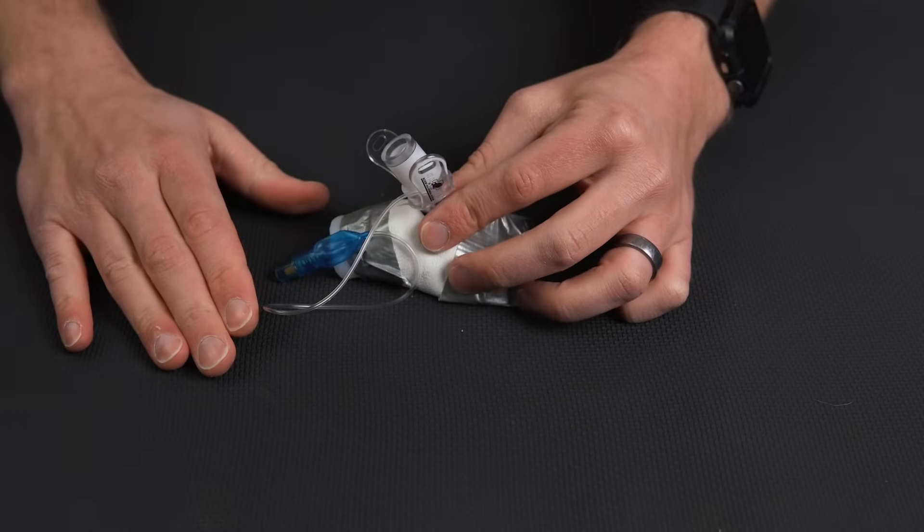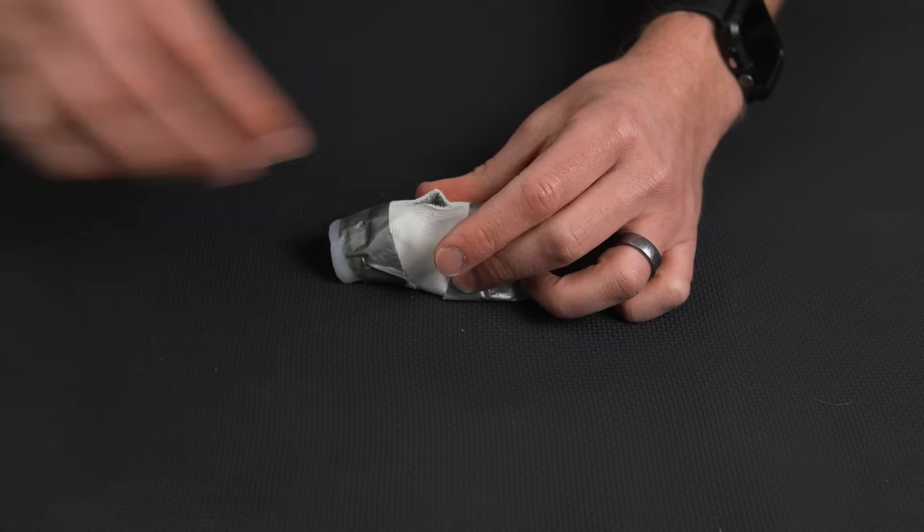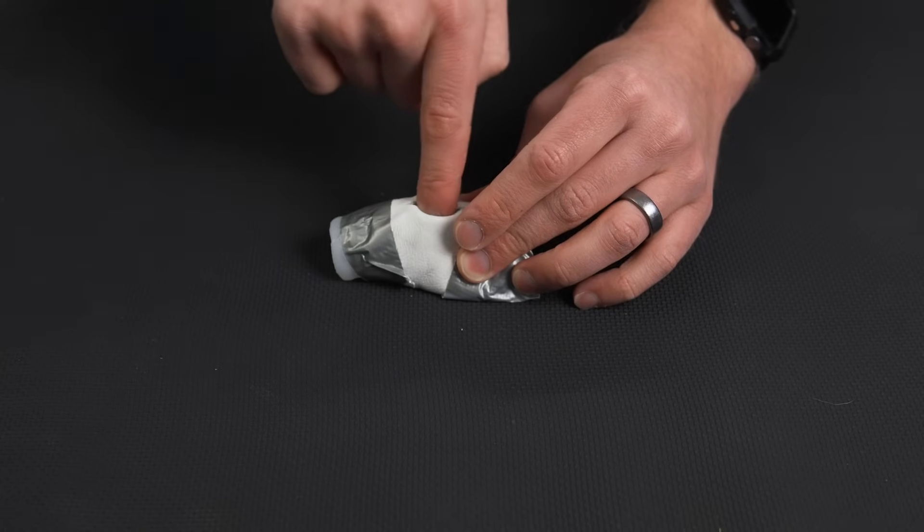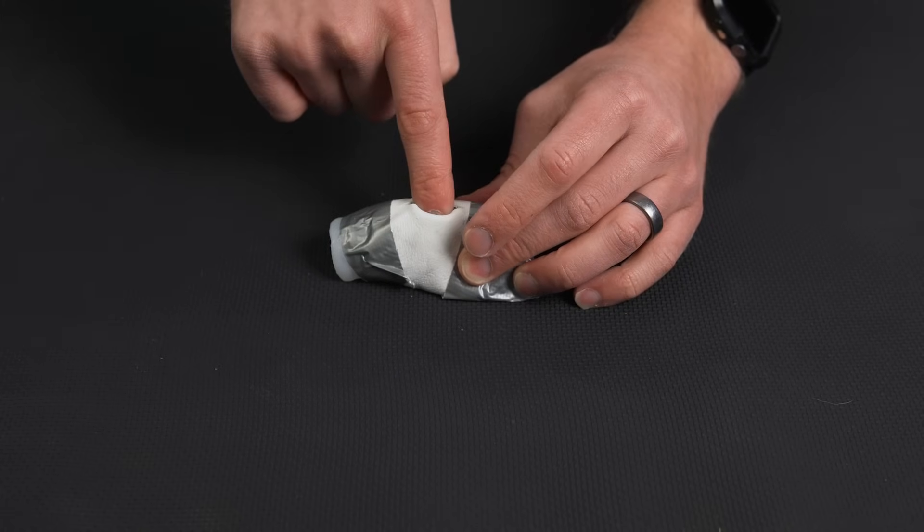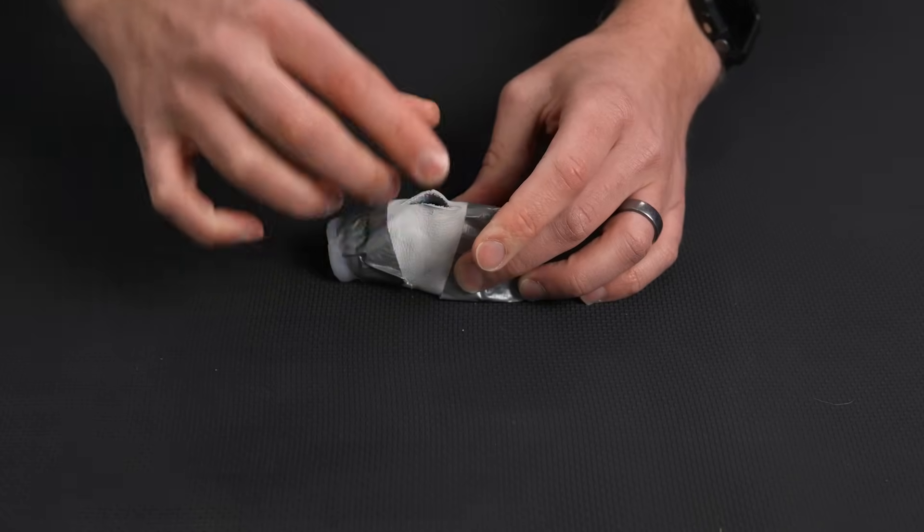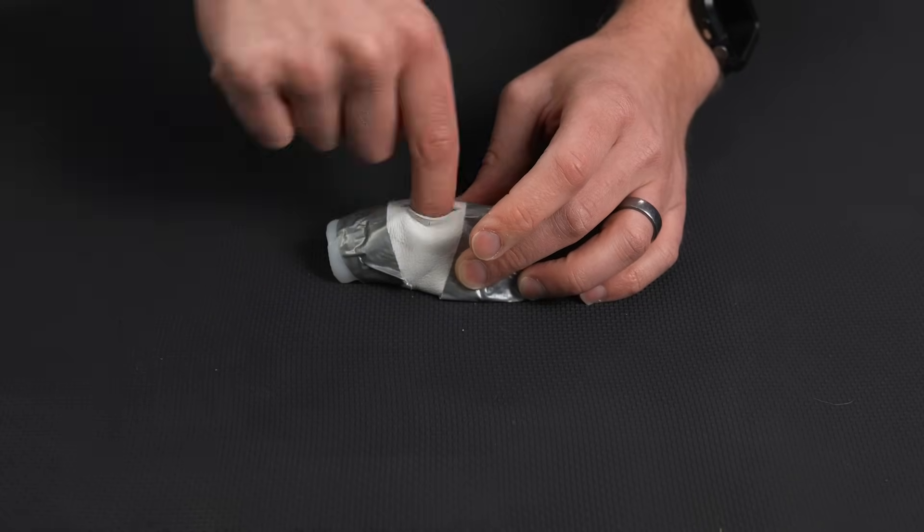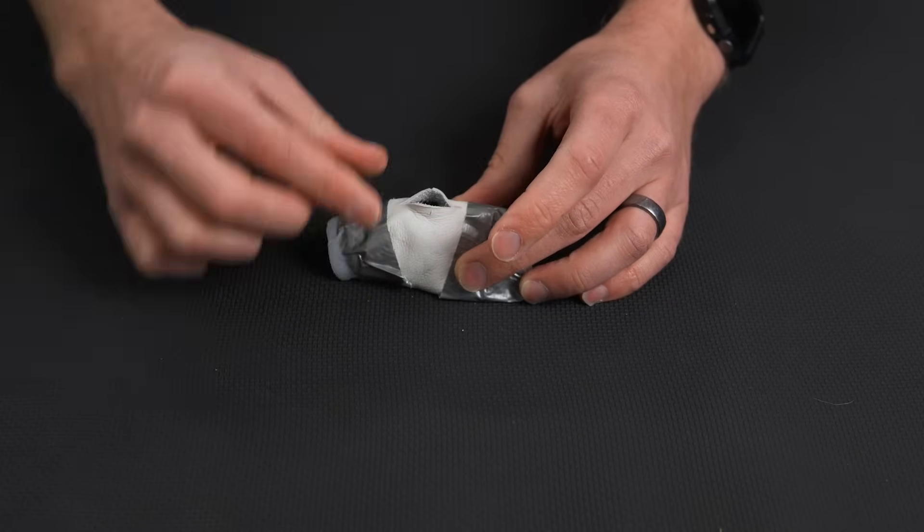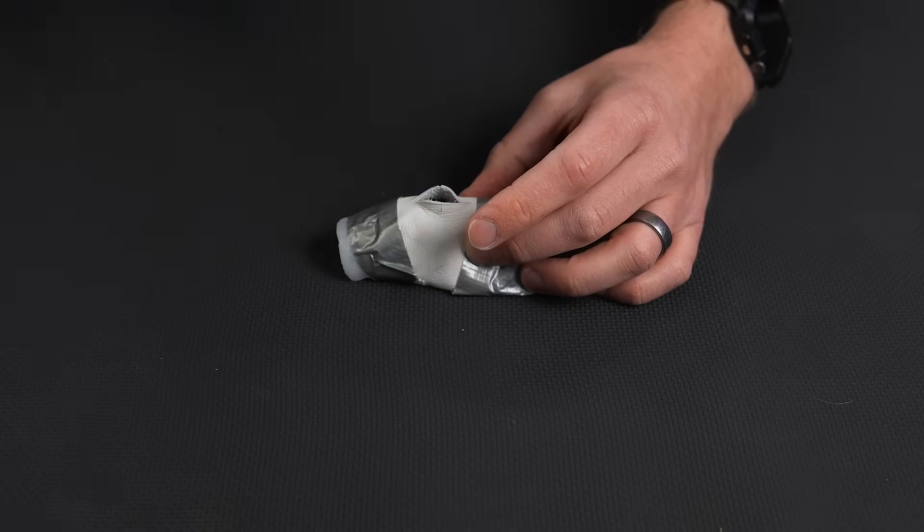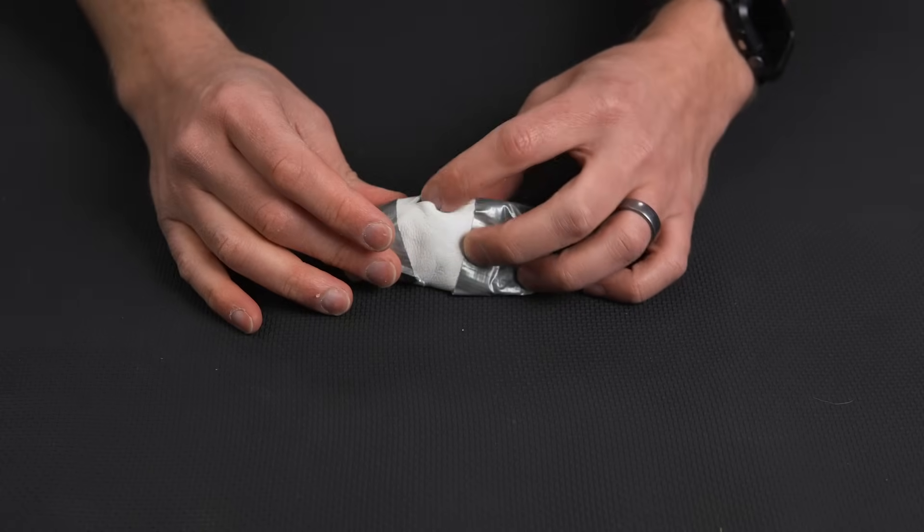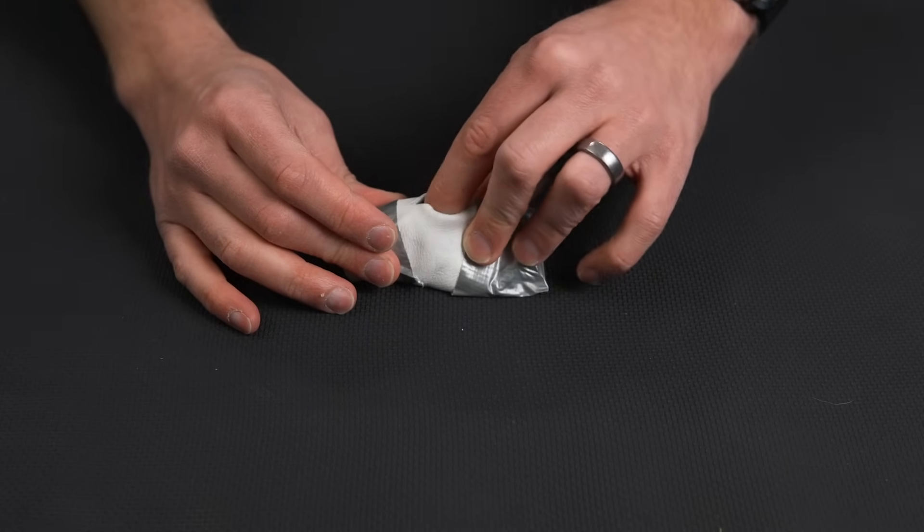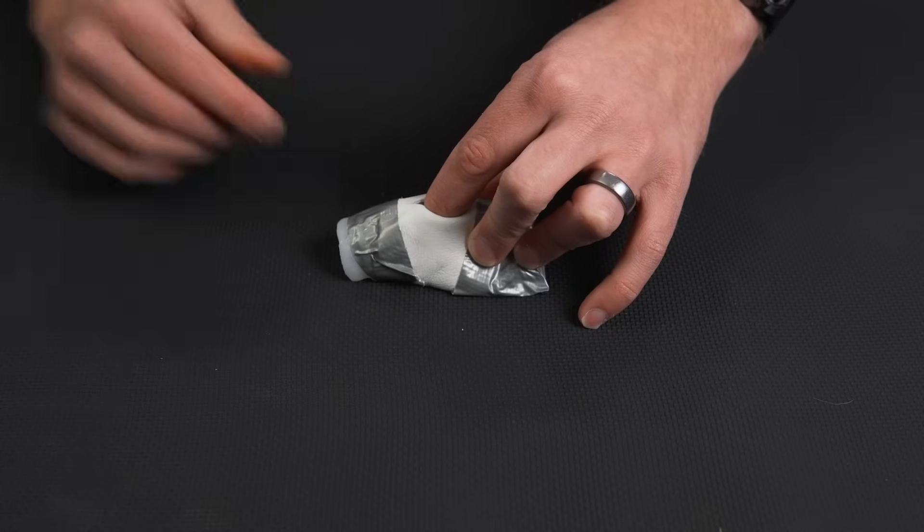We're going to take our syringe. We're going to inflate the cuff with 10 mls or whatever is recommended with the device you're using. Generally, 10 is going to be just a little bit much. And we're going to take a bag valve mask and we're going to bag over top of this. A couple important points with this procedure. It is really important that when we make that first incision and then we make the second one, that we are limiting the time that there is nothing in this orifice we have created.